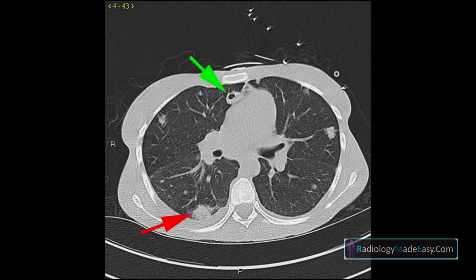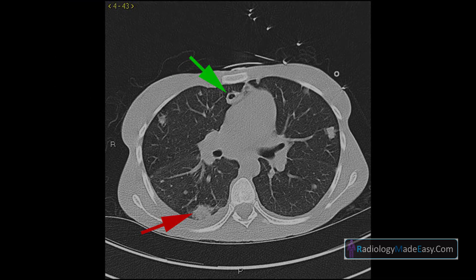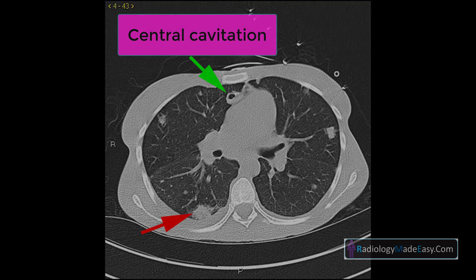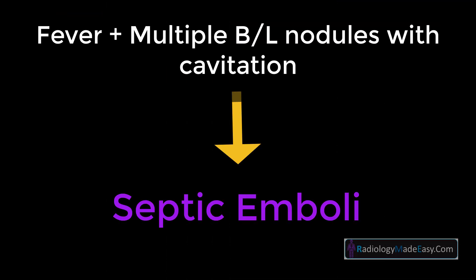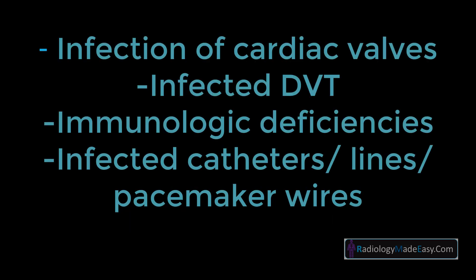The CT of the chest confirms multiple bilateral pulmonary nodular consolidations. The lesion indicated by the green arrow demonstrates central cavitation. In this patient with fever, multiple bilateral nodules with cavitation, the findings are most consistent with septic emboli.